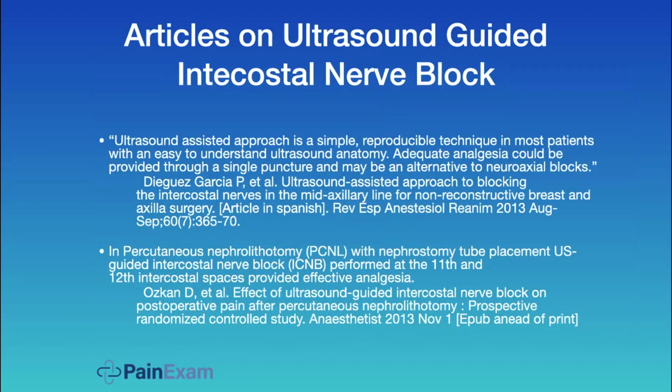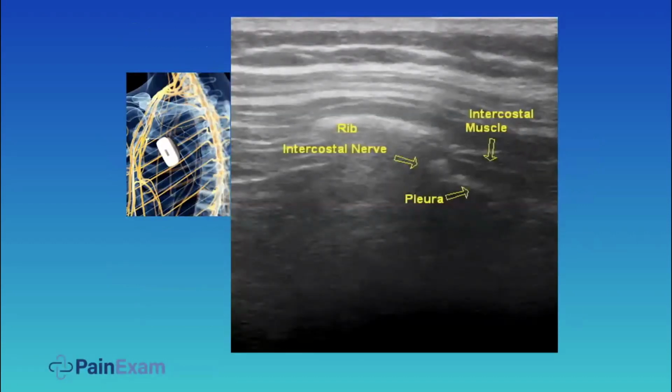And of course, it's all cheaper than getting a pneumothorax, hurting a patient, getting sued, if we're going to talk dollars and cents. There's plenty of articles to support the use of an intercostal nerve block for various reasons. They've used it for post-anesthetic, for intraoperative pain relief for a nephrolithotomy at T12. They've used it for thoracotomies. They've used it for all sorts of procedures.